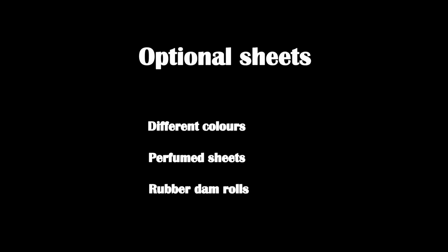Now, operator efficiency is always prime. All other things come second. So you have to have one or two colors of your choice for documentation. When you know that you're going to document this case, then you use colors, maybe purple, maybe teal for your isolations. Perfumed sheets.